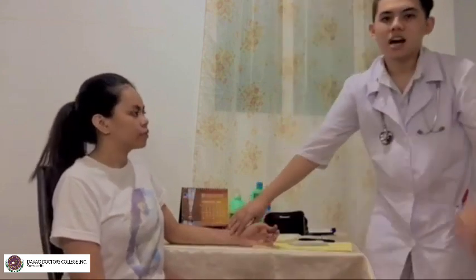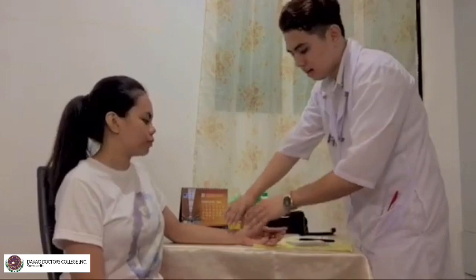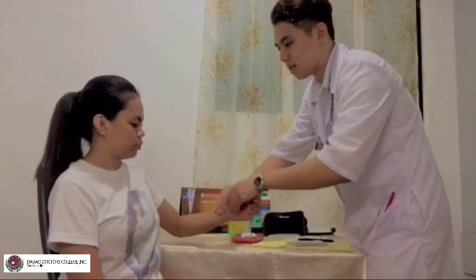Okay. So, count the respiratory rate for 30 seconds if the respirations are regular, but count for 60 seconds if they are irregular. And, of course, observe the depth, the rhythm, and the character of the respirations by watching the movements of the chest. So, mag-start na ko, ma'am, ha? Normal lang, ma'am. Wala kay buhaton. I-place lang nako diri, ma'am.